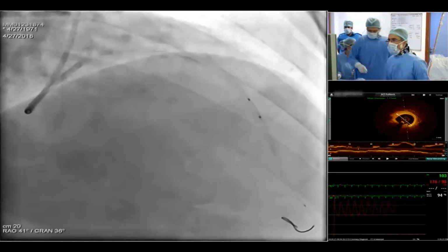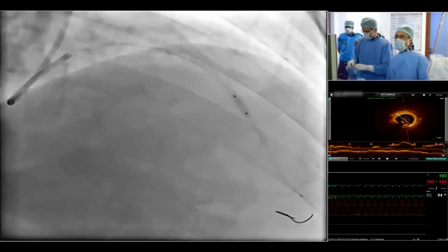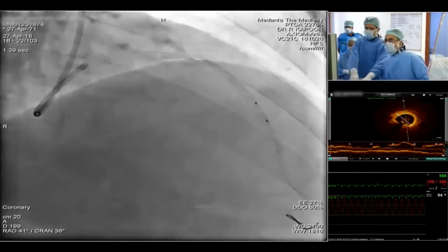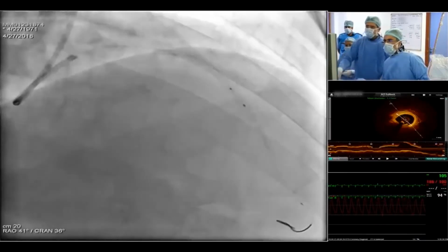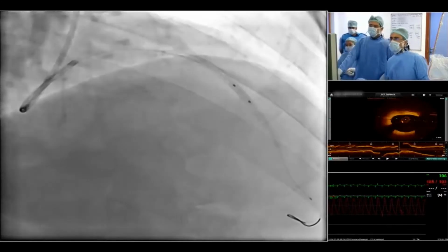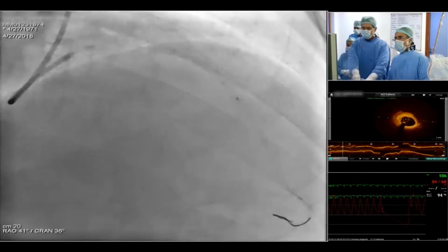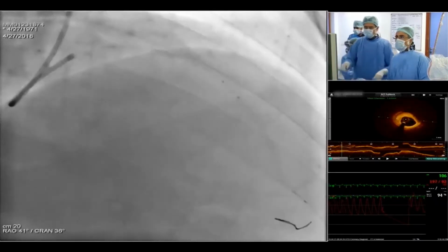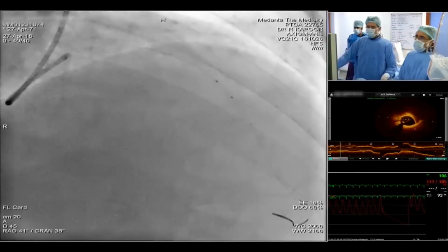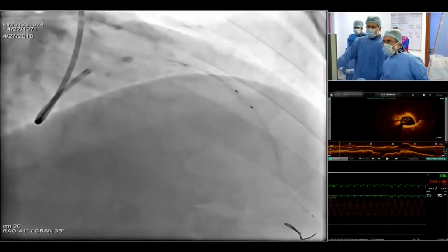Okay, go up. 6, 8, 10 down. 6, 8, 10 down. Check. Is there a small gap in between the two stents, or are they overlapping? There is a small gap, so no, they are not exactly overlapping. The stent was falling short, but then we were not getting a good overlapping zone.